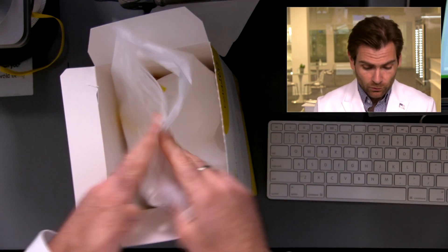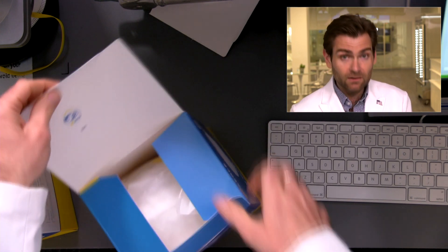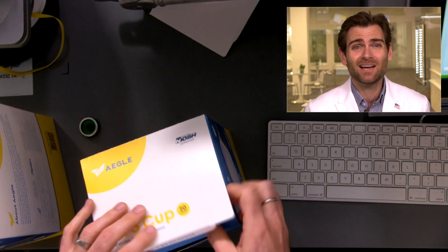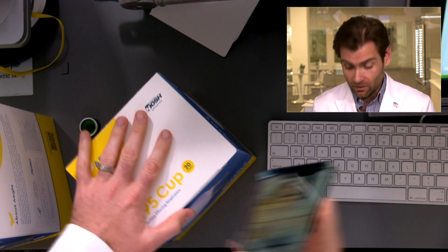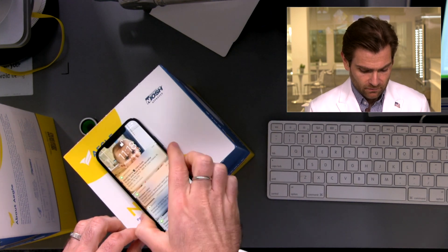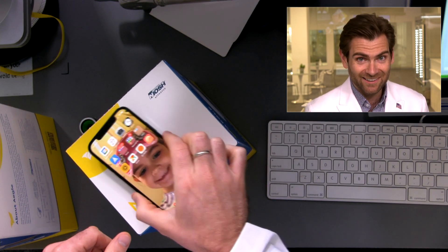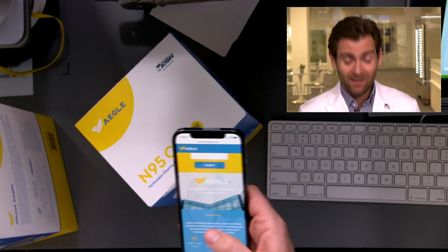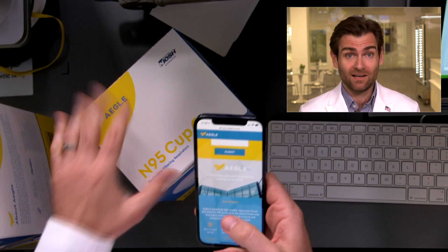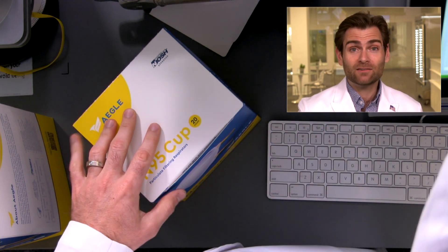Let's talk about this box. It has a really cool feature - on the top of every box there's a little sticker that's actually an NFC, Near Field Communication reader, and they're using that to do real verification of the information. You just tap it on the top and it opens up their website and shows you the lot information - the date the mask was manufactured, the time it was manufactured, and all of the testing data. They've done about 20 tests from that lot. That's a great way to know you're dealing with an actual US-made company and that it's actually been verified.